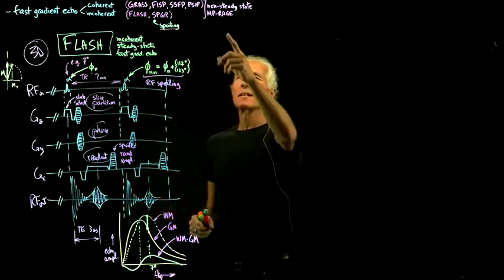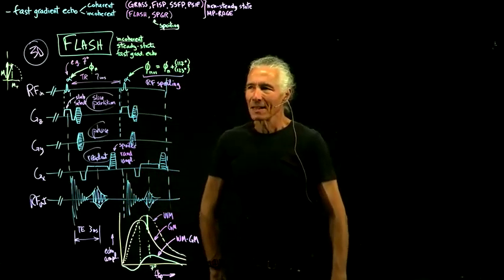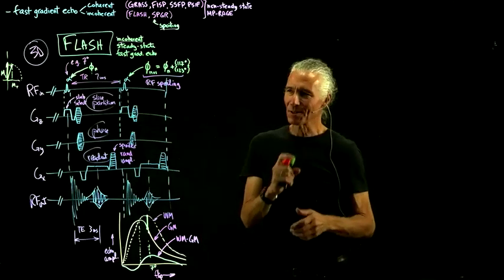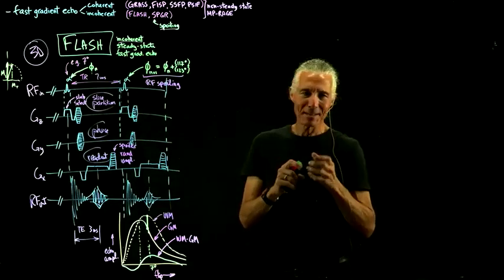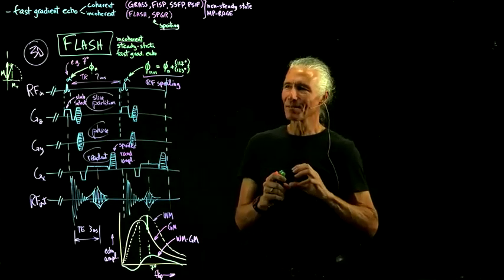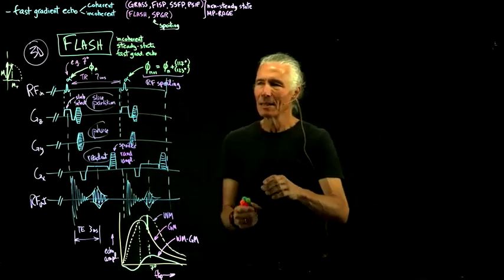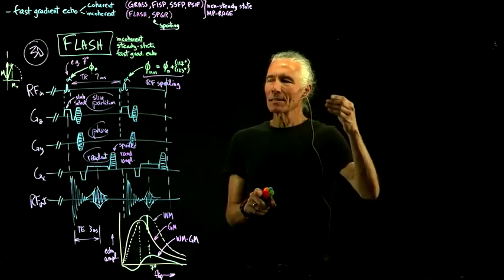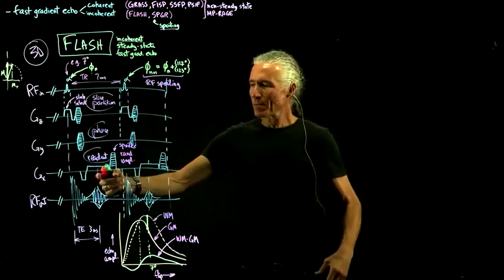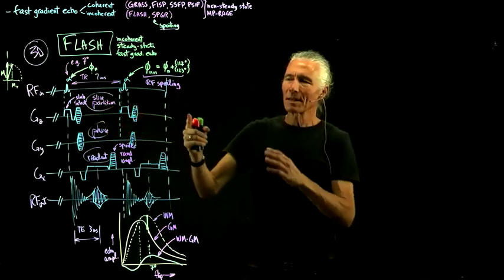And then what about MPRAGE? MPRAGE is a non-steady state scan. We've just slowly hacked away to make something that works better, but then it gets a little ill-formed. What does it mean that it's non-steady state? It means something is changing across the collection of data. Here, once you get into the steady state, you can just collect a pile of data.